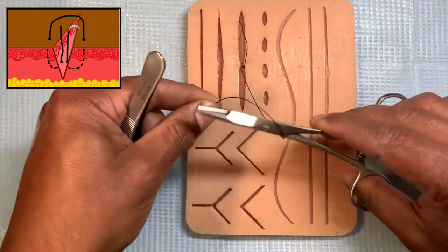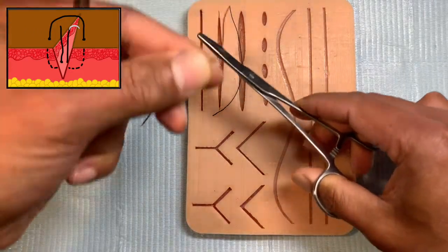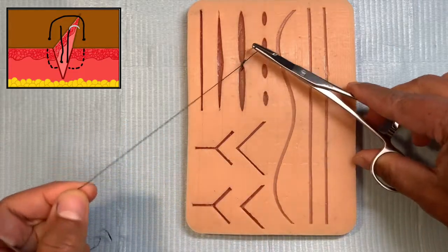And then you take one forward. And then you take another one reverse. So this becomes a 2-1-1.